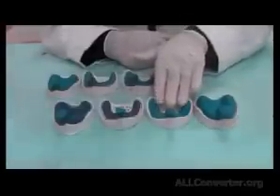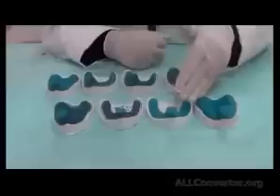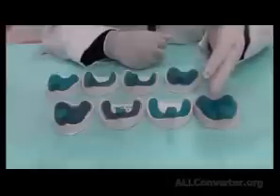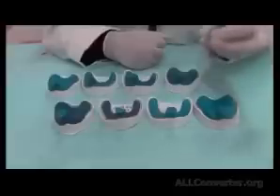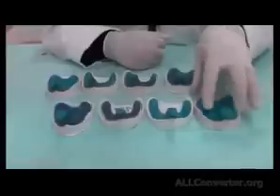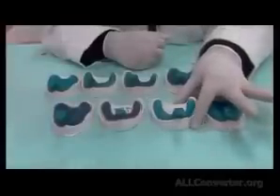So the denture will immediately go to the compressed state. The problem is not all tissue can withstand such pressure, and then we will have problems of resorption, pain if the nerve is crushed, maybe a twitch or some uncomfortable feeling, and trauma if we have thin mucosa. So the compressive status will cause problems in the short term and the long term.